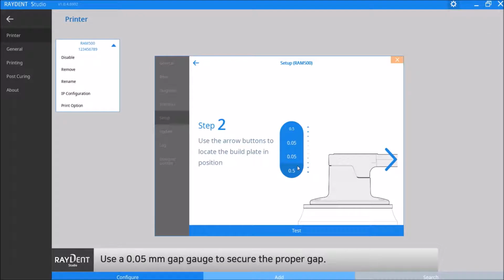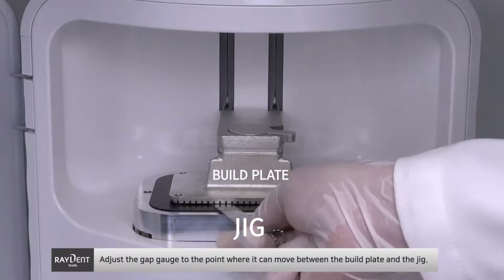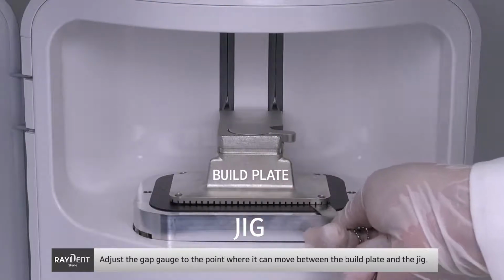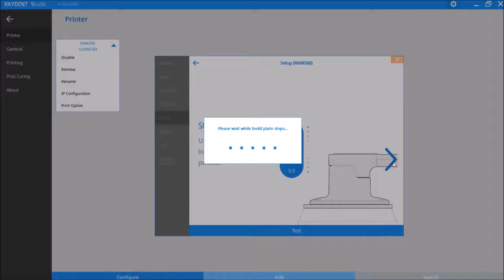When you do that, use a 0.05 thickness specimen to determine the gap between the build plate and the jig. If the specimen barely goes through the interval gap, then you're all set. When you're finished modifying the interval gap, go ahead and click Test, and click Next once it's done.